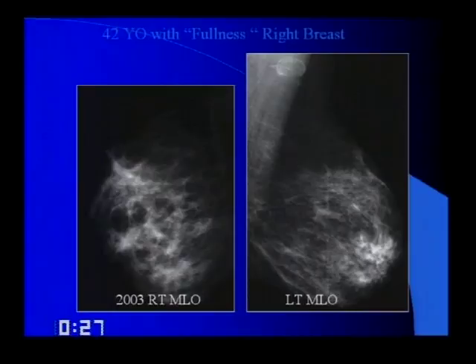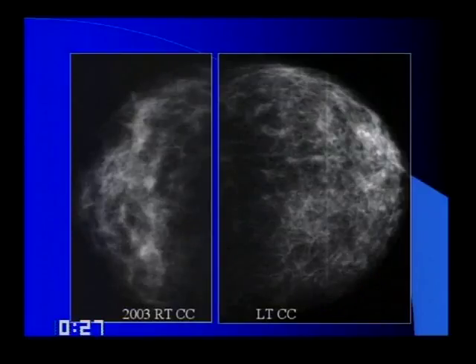And I think that you can see that in invasive lobular carcinoma when there's no underlying mammographic abnormality except a shrinking breast, no underlying mass or calcifications. Okay, that's very good. This is the shrinking breast sign, which is a sign of infiltrating lobular carcinoma.